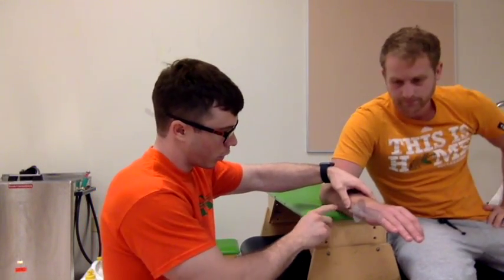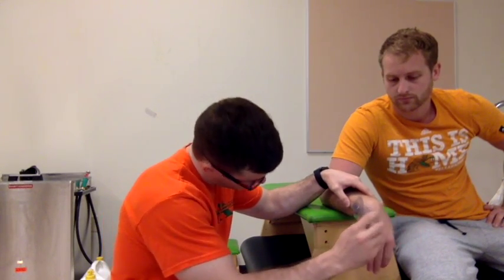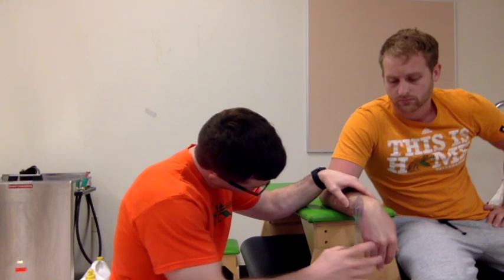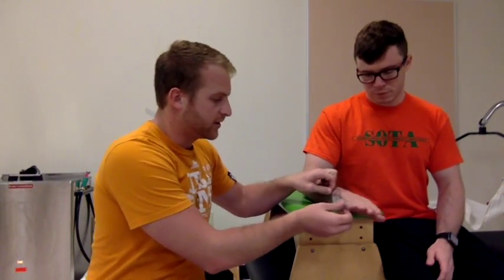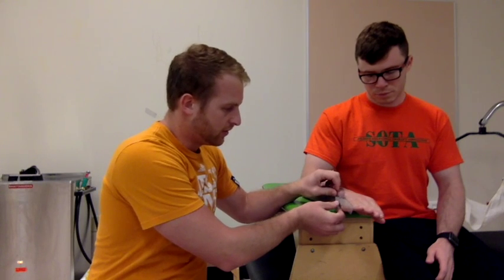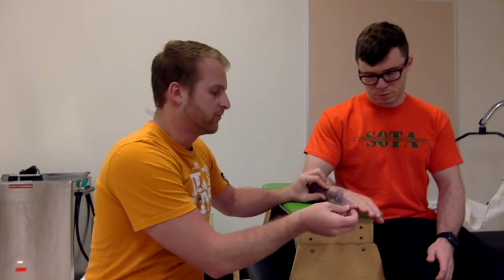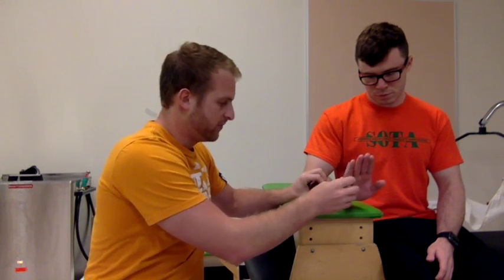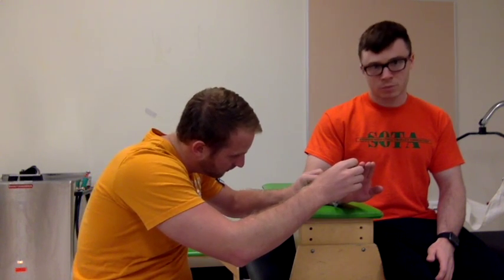For wrist flexion, we have the axis on the pisiform, stationary bar on the ulna, and movable arm on the 5th metacarpal. Go ahead and perform flexion. Looking right at 79 degrees of wrist flexion. This is wrist extension. We have the axis on the pisiform and the movable bar on the 5th metacarpal, the stationary bar on the ulna. And right now we have 45 degrees.